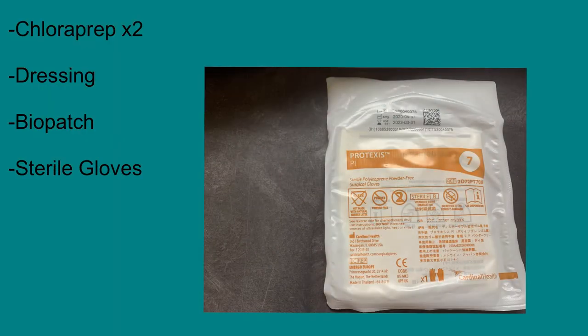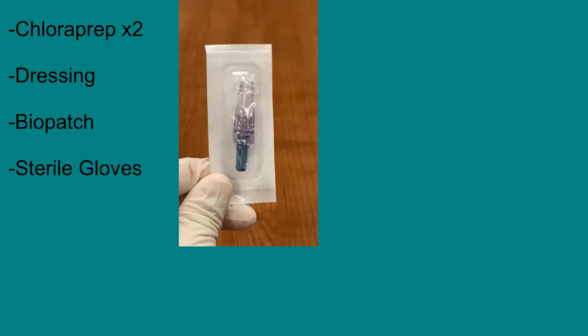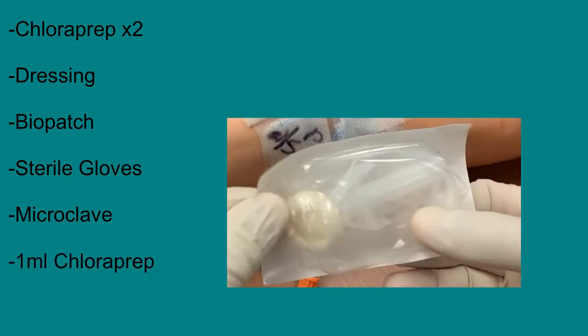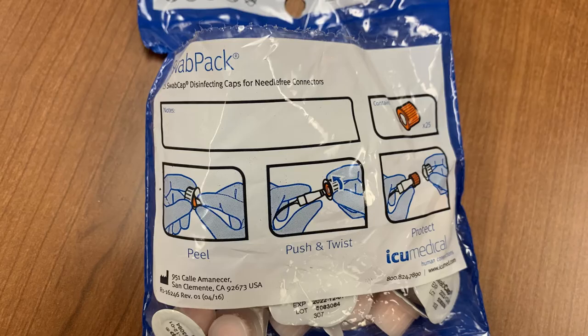Obtain appropriately sized sterile gloves. You will also need to replace the microclave, or the needleless adapter at the end of the line. So have a new adapter and flush ready, as well as a small chlorhexidine swab, and the swab caps that should always be present at the end of every IV line.